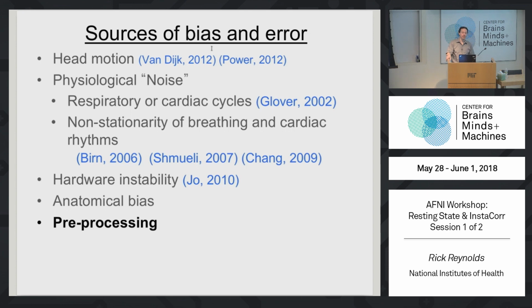It's not really a new thing. The hard part that people really hadn't been doing is censoring in the context of band passing. Band passing was a typical preprocessing step. Censoring was a typical preprocessing step, but basically no one was doing the two at the same time. So now we can do that. We'll get to that in a bit.